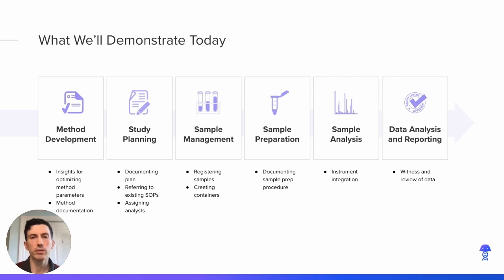Bioanalytical development really spans a lot of different key deliverables. I have those here up on the slide, an overview of that workflow, but you'll see it's starting with method development and ending with validation at the end of that stage. And then once these methods are validated, the bioanalytical team will perform these validated assays on samples that are received from maybe a preclinical in vivo study or a clinical human study.